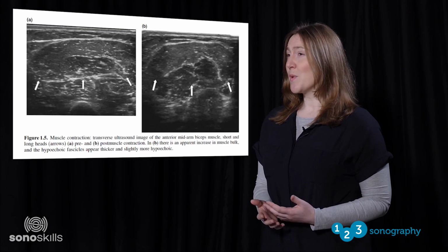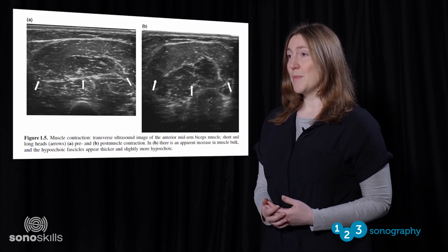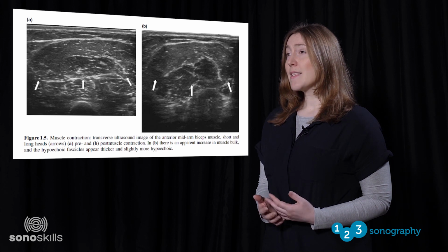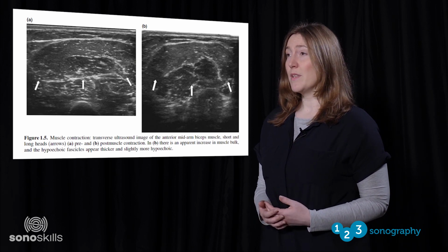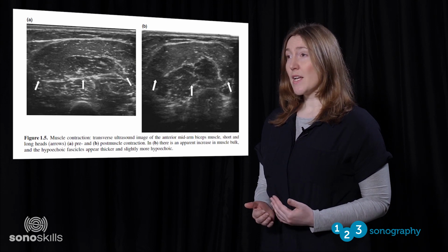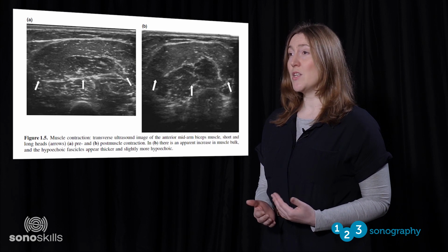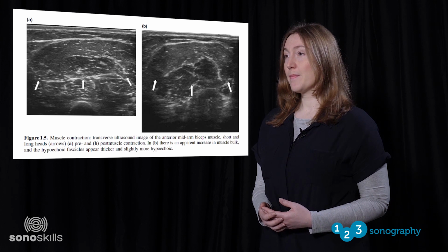Are you ever in doubt whether a muscle is contracting as it should be? Do a functional assessment. Ask the patient to contract the muscle or apply a resistance to a certain movement. Visualize the difference and make thickness or cross-sectional measurements to quantify the change in muscle volume. It may help your clinical reasoning.